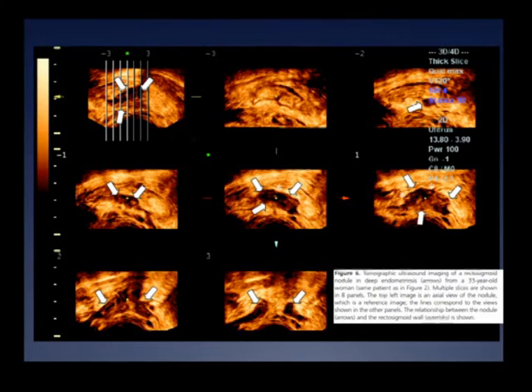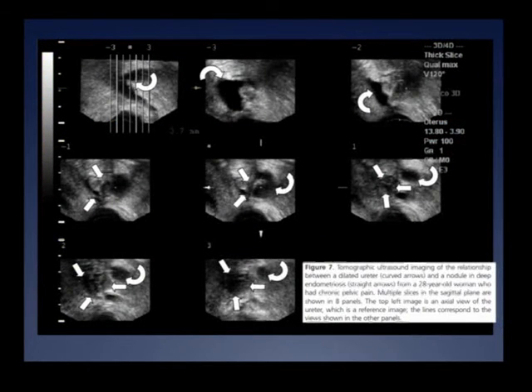It's with a lot of additional information with the relationship with the, remember, no? The hyperplasia of the submucosa, the muscularis, there. This is hypertrophic. This is the relationship with the ureter, the nodule, and the distortion of the ureter, the medialization of the ureter.